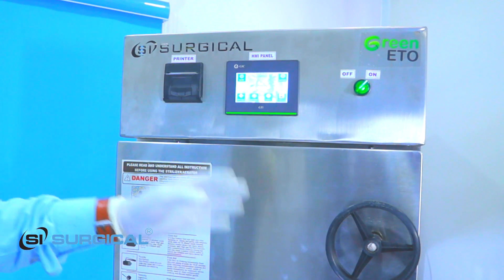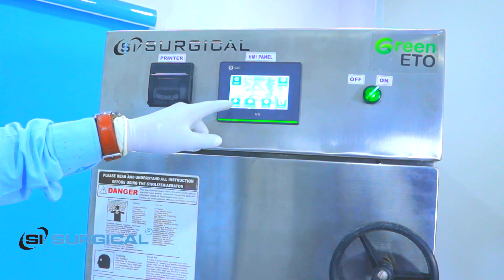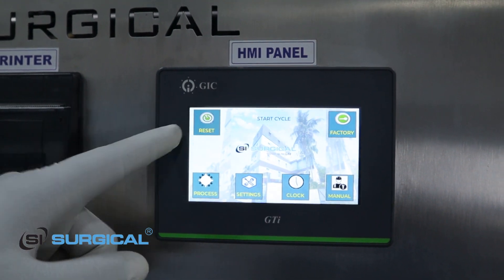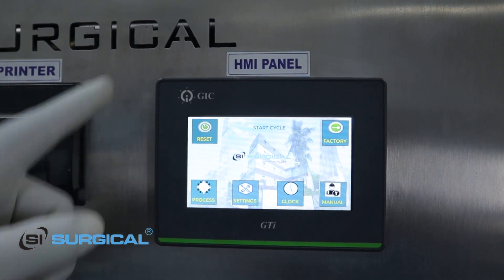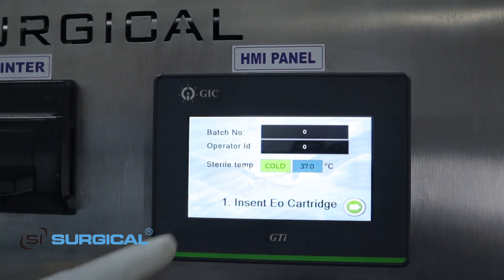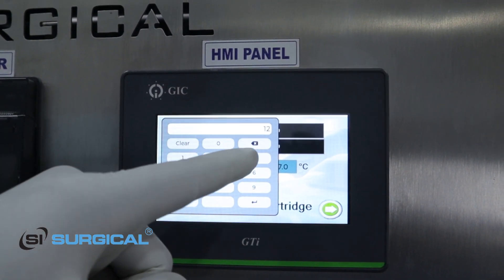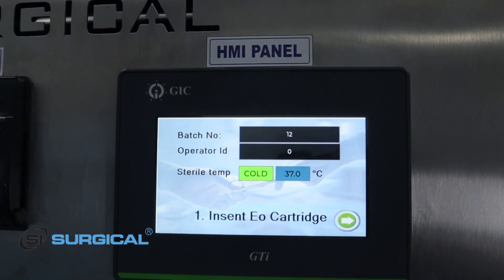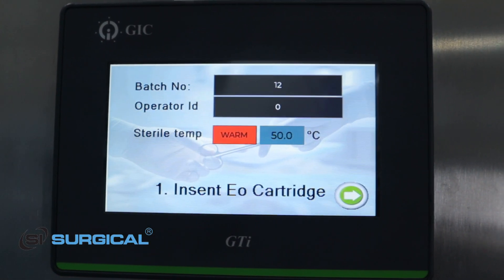After locking this gate properly we are going to operate this machine. Now we have to go to process first. Here in the display, this is our homepage and here is reset, process, settings, clock, manual, and factory. For automatic process we have to choose process first. You can see there is batch number and operator ID which I can set. I have to put the operator ID.